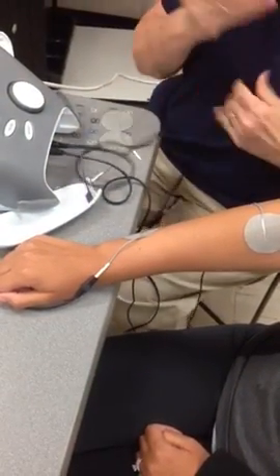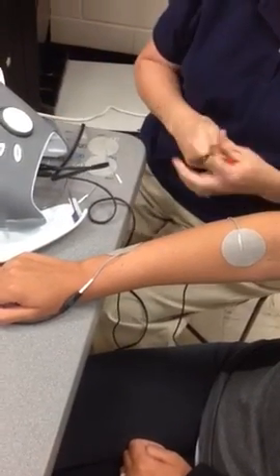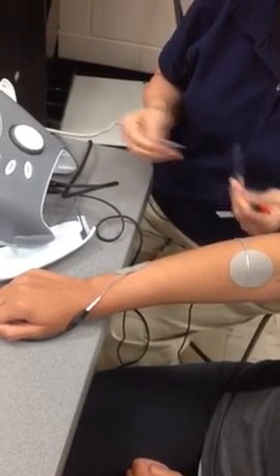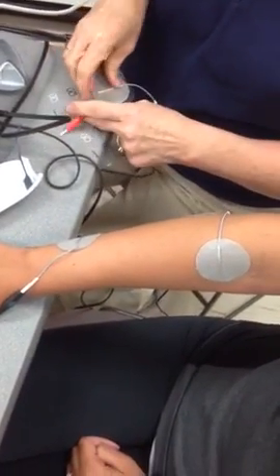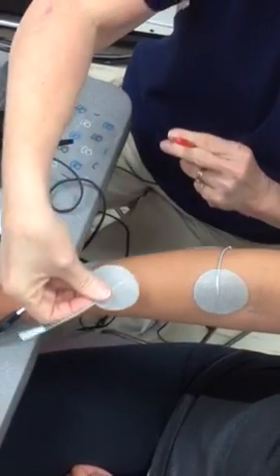And then with the second channel, you also want to crisscross your electrodes so that where they cross would be the area that you're wanting to treat.